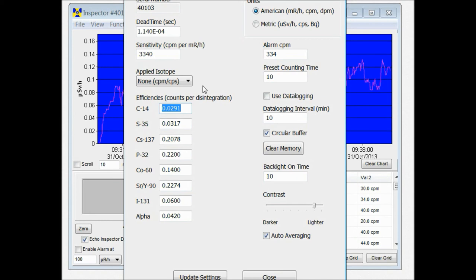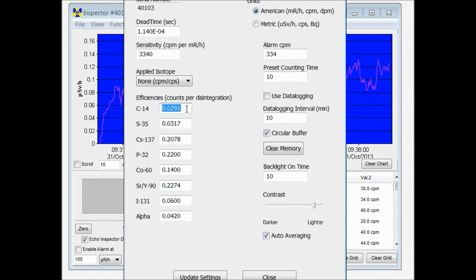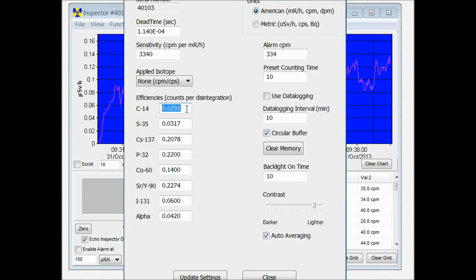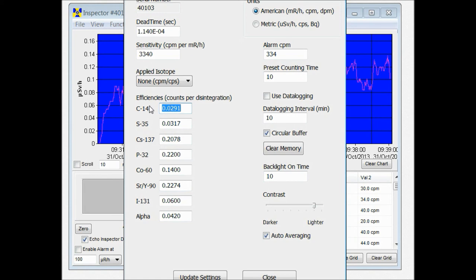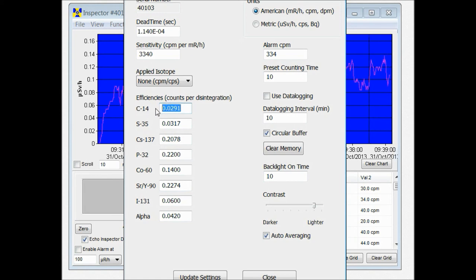So if you're trying to calculate the efficiency of an isotope that's not pre-programmed into the inspector, you can change one of these isotope efficiencies and program in the efficiency of the isotope you're trying to calculate the activity of. Then when you go back to your unit and select that efficiency, just remember which isotope you used as a marker so that when you select that isotope, it's using the isotope efficiency that you programmed in.